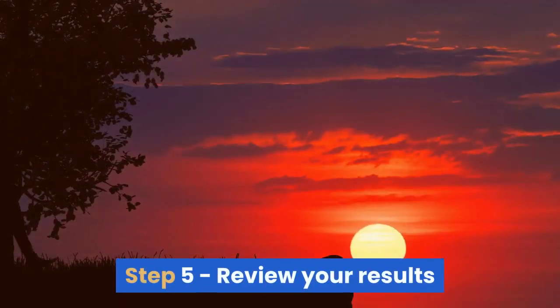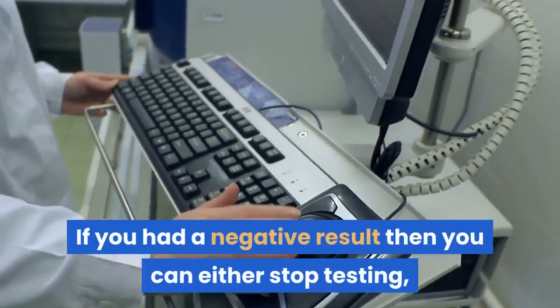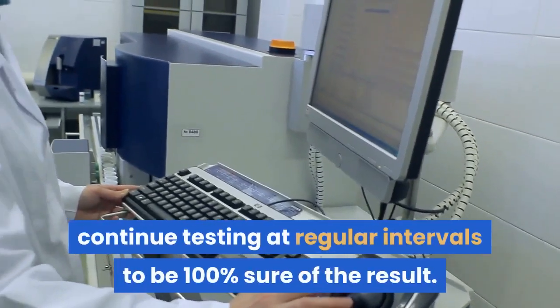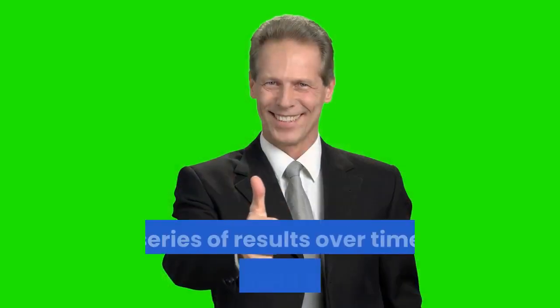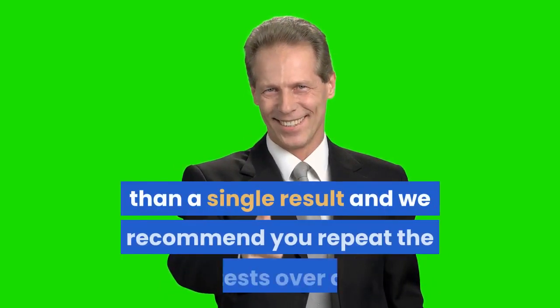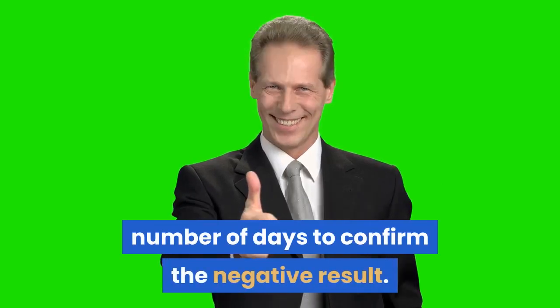Step 5: Review your results. If you had a negative result, you can either stop testing, or if you wish, continue testing at regular intervals to be 100% sure. A series of results over time is much more reliable than a single result, and we recommend you repeat the tests over a number of days to confirm the negative result.